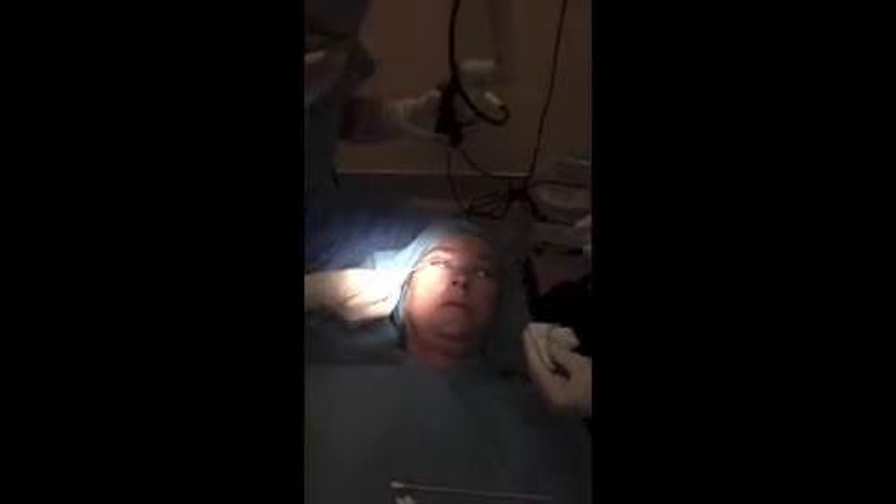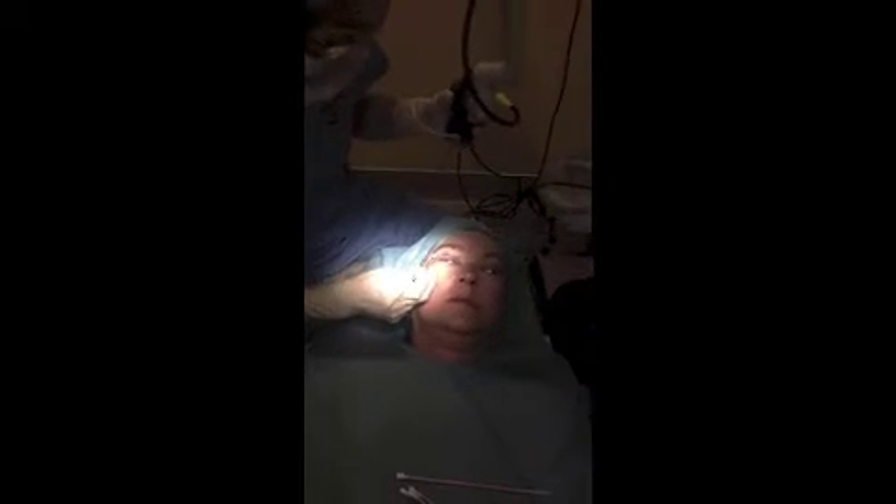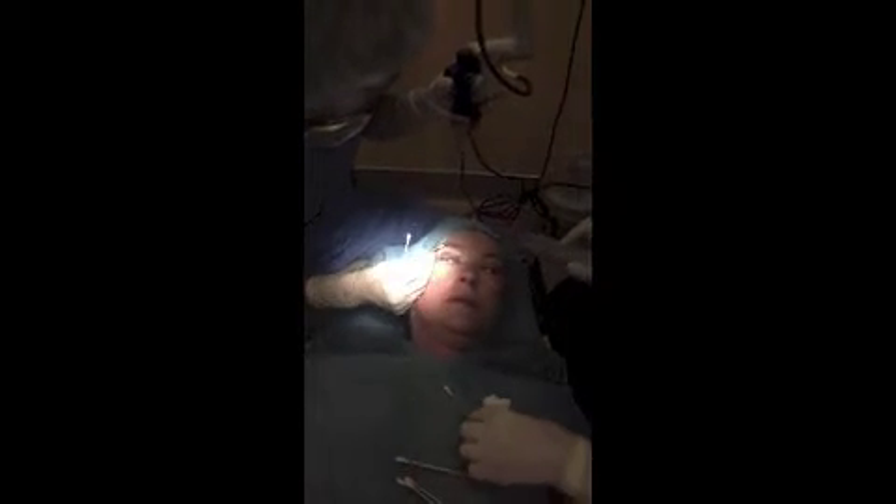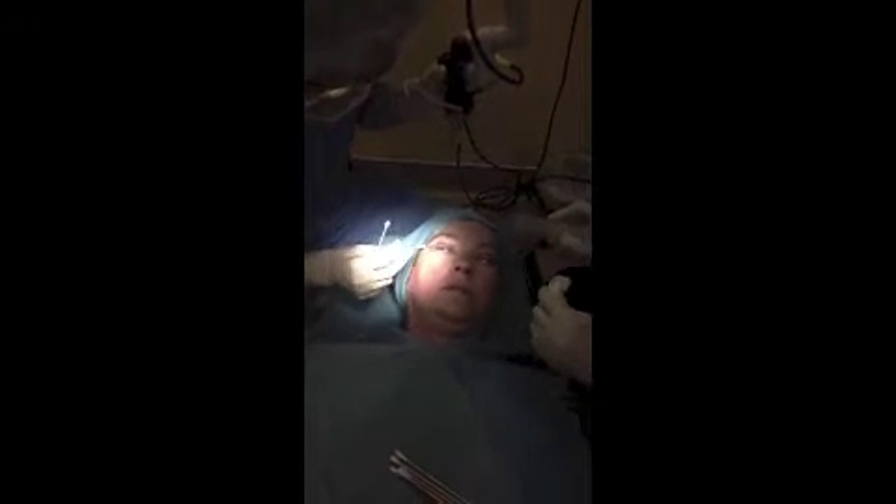I'm going to do that with the active. I'm going to go right in. Other side. We've got to do the second part of this. So we're doing what's called a Total FX, which is the Luminous Total FX. This is the Deep FX — it's called the Deep FX. And then the other one's called the Active FX, and it's more superficial. And you put them together.